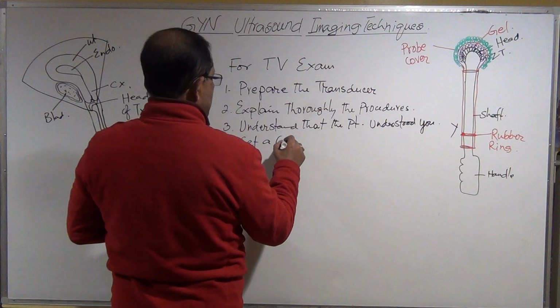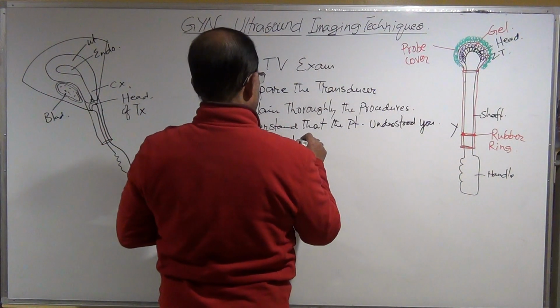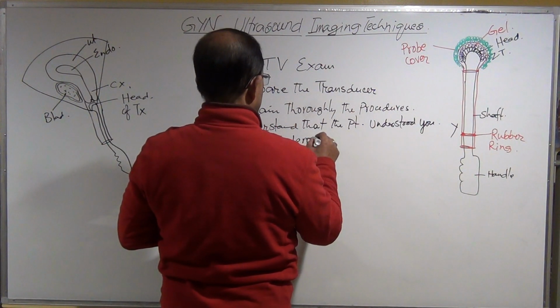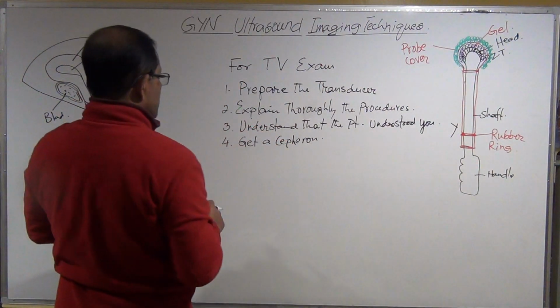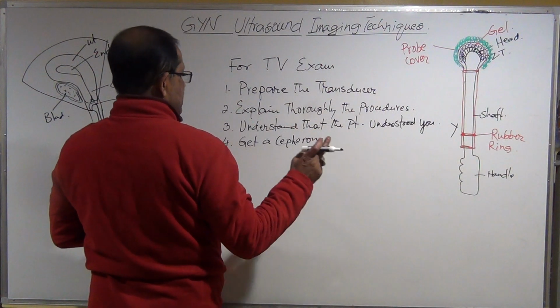Get a chaperone. Get a chaperone if you need it, because if you are male, get a chaperone.